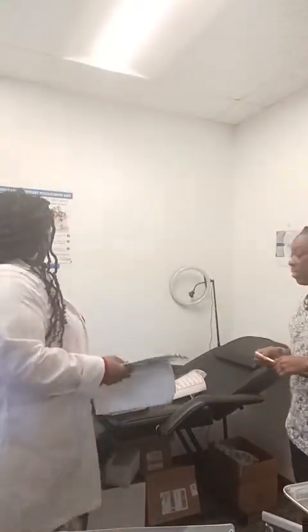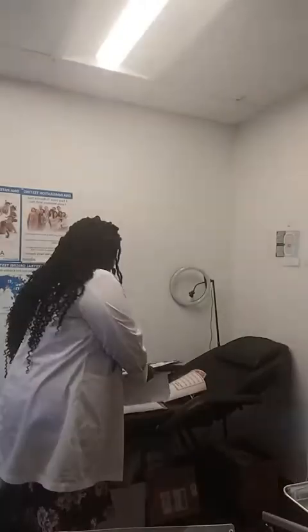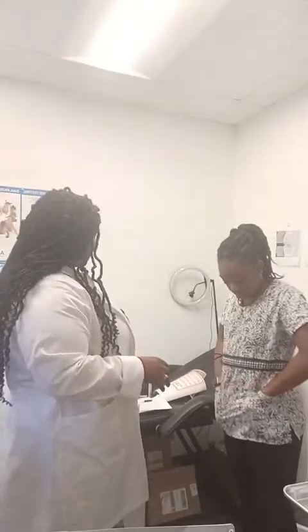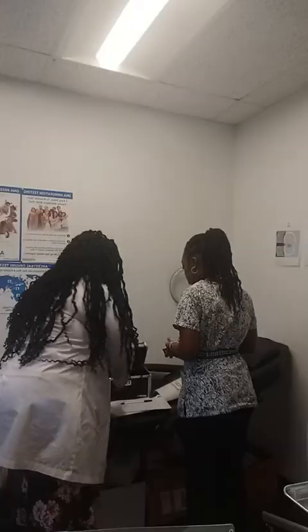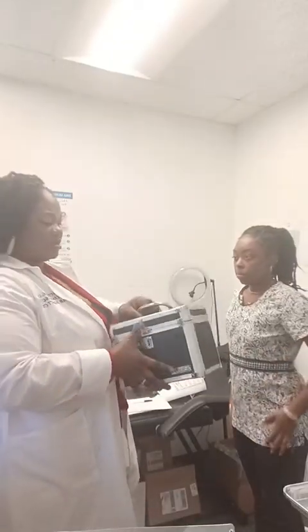Thank you, Mr. Isabel, you're done signing in. Appreciate that. What I want you to do right now is for you to empty out your pocket. You have to remove everything and put it in this lock box. Thank you. I'm gonna instruct her to put everything in the lock box because we do have to secure and maintain the integrity of the test. So everything is in the lock box.